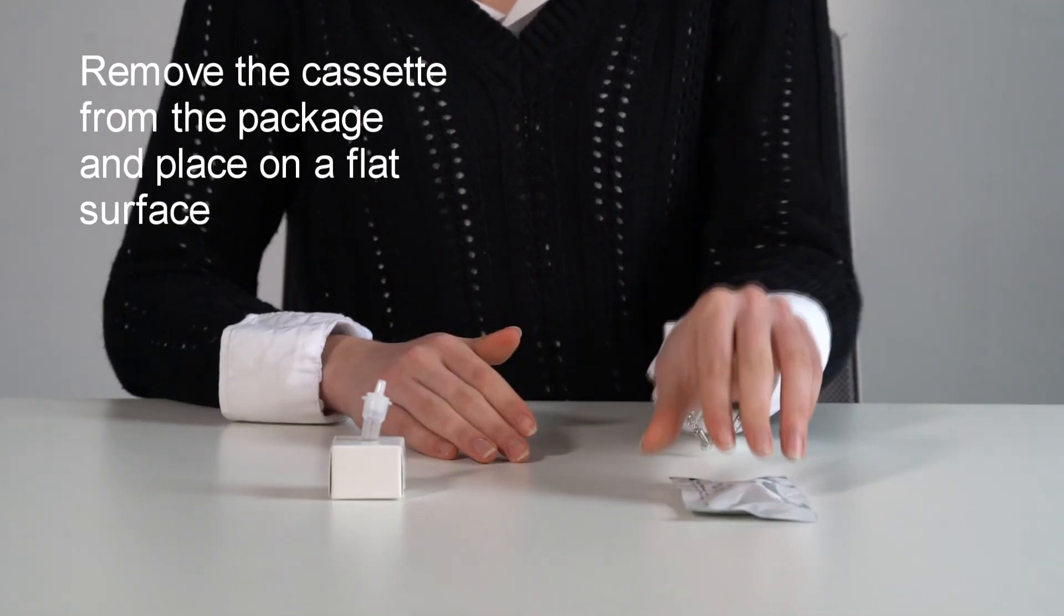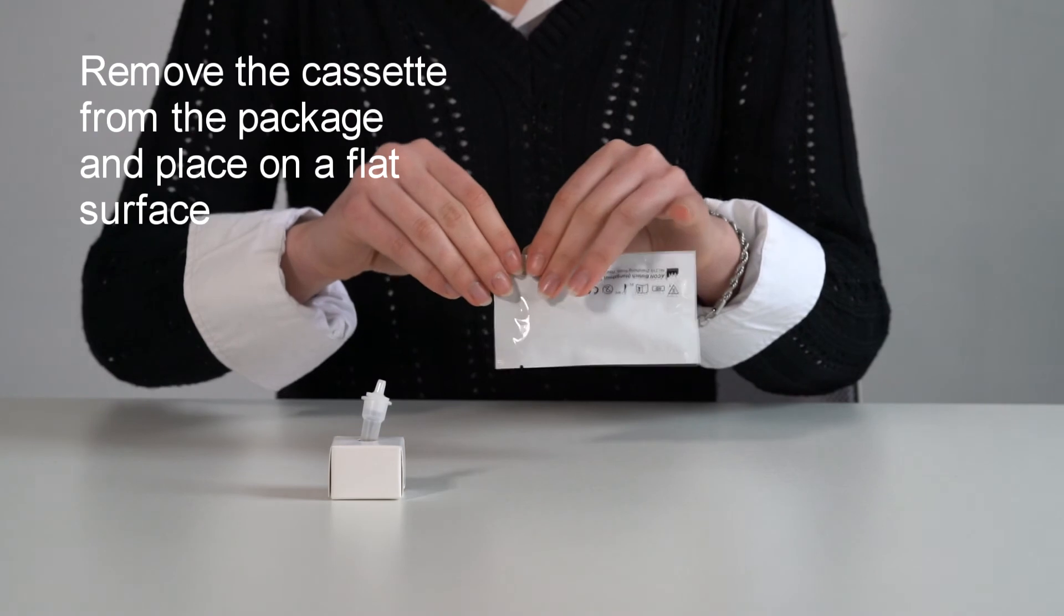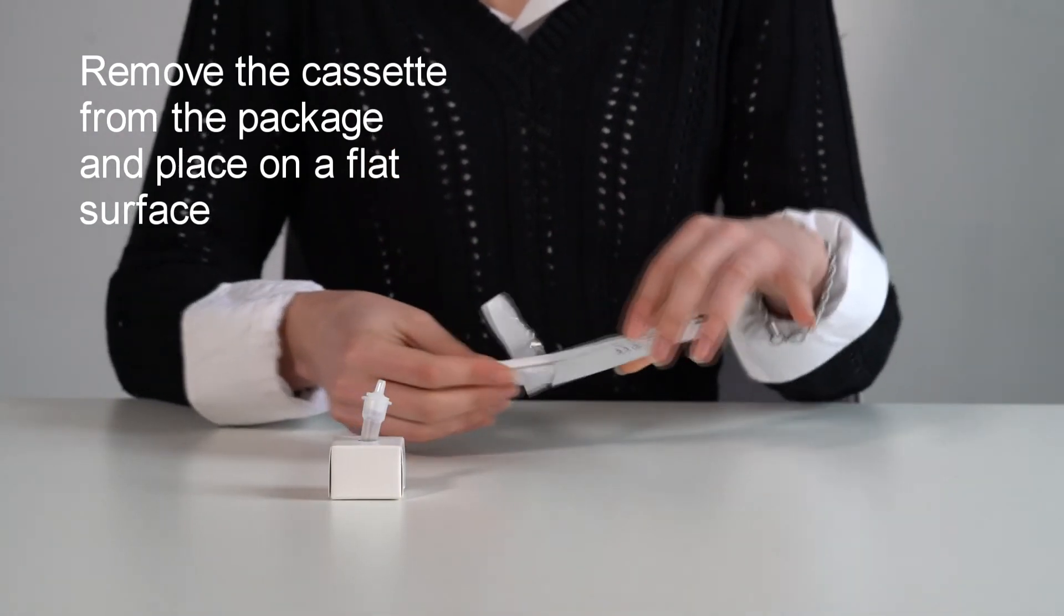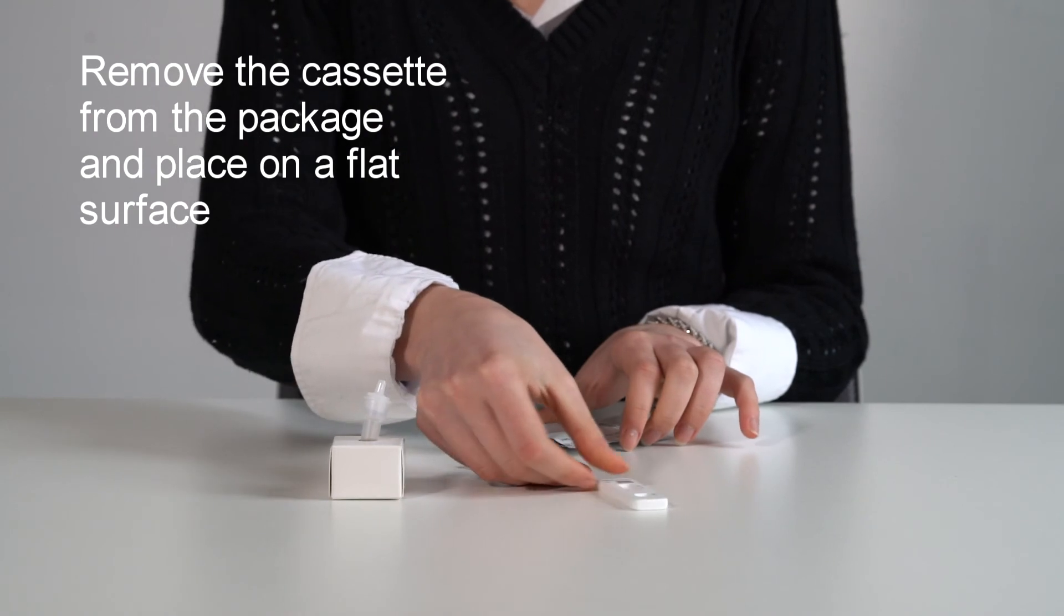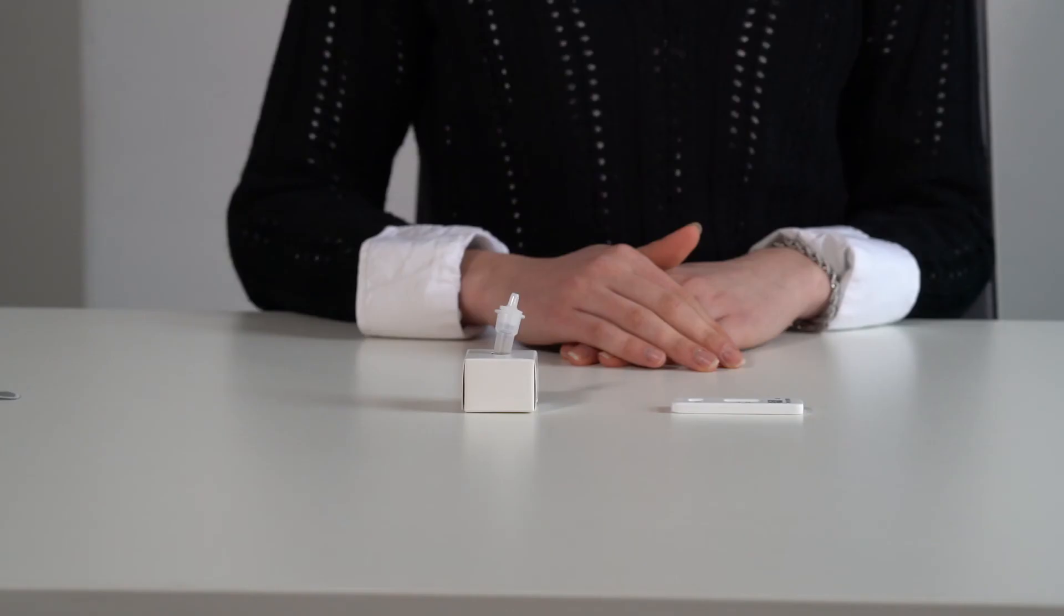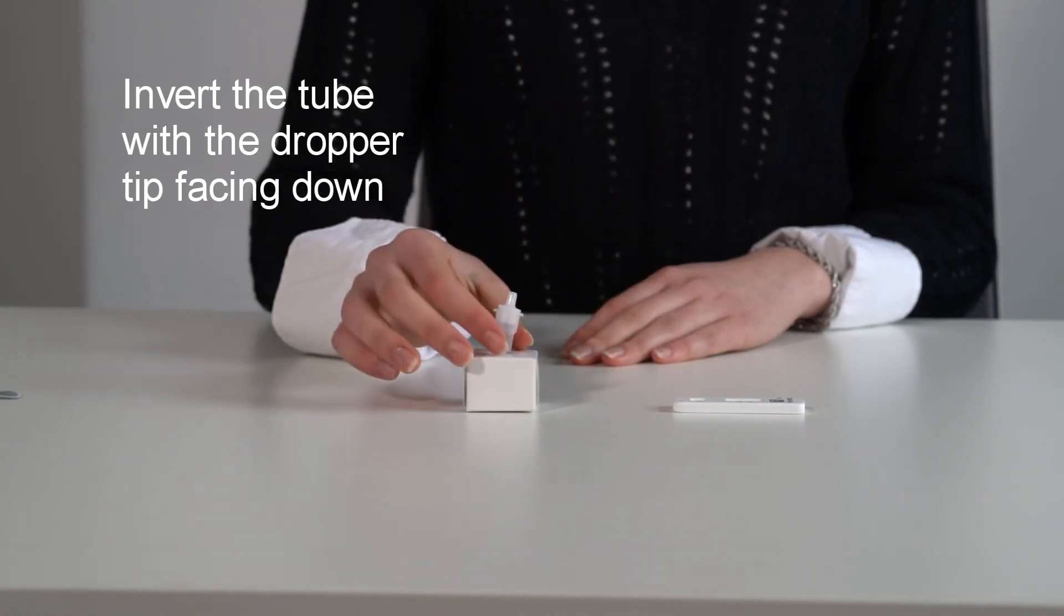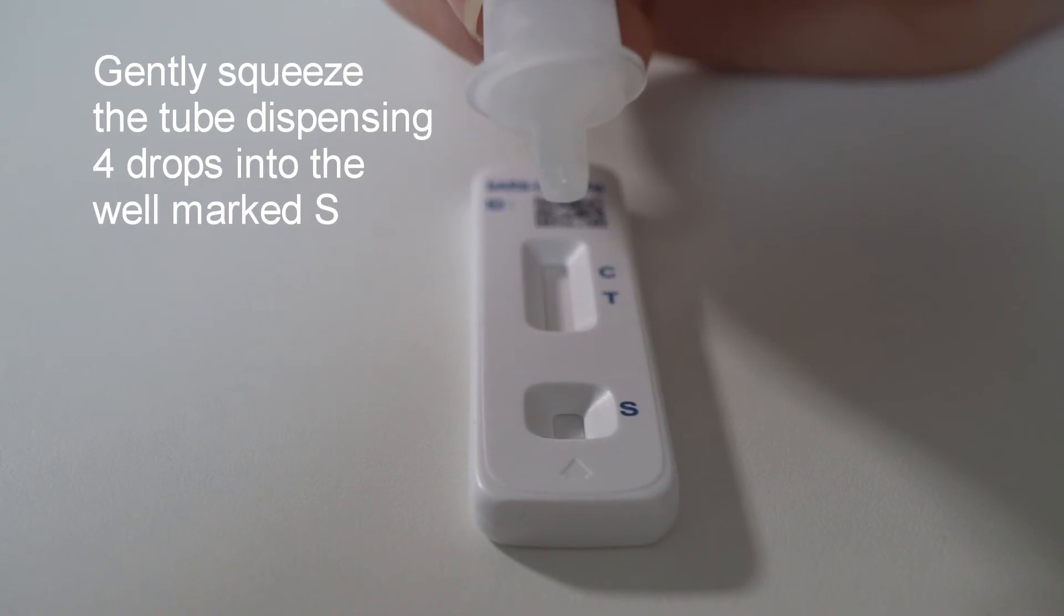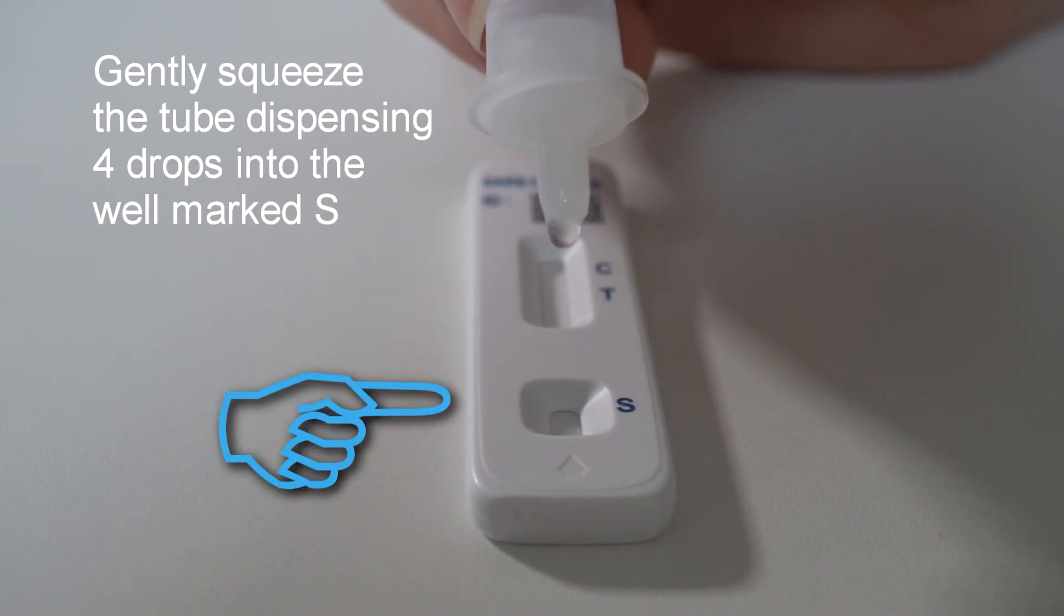Remove the cartridge from the foil packaging and place it gently onto a flat surface. Invert the tube and release four drops into the sample well area, denoted by an S.